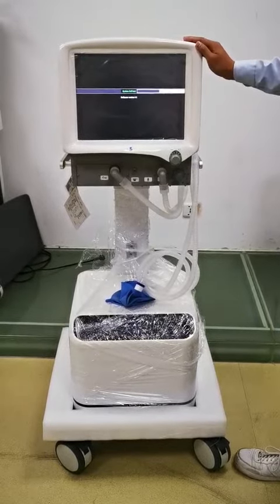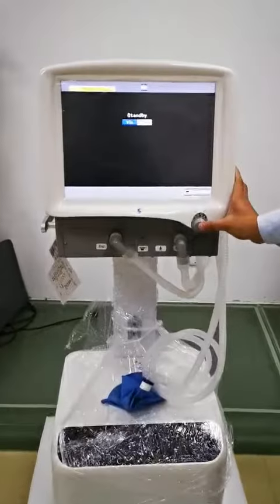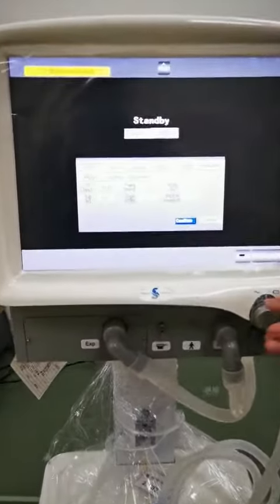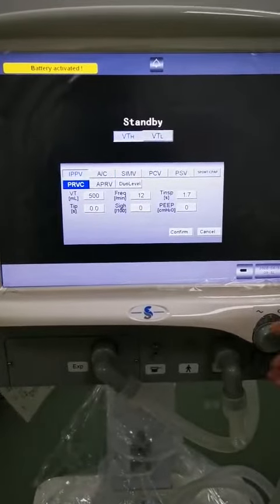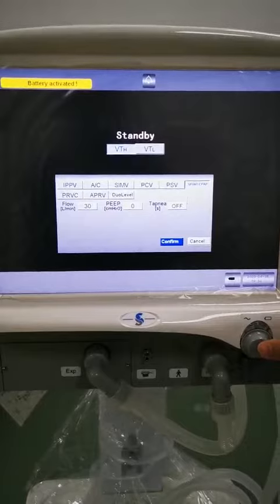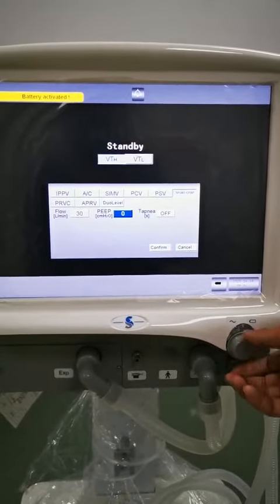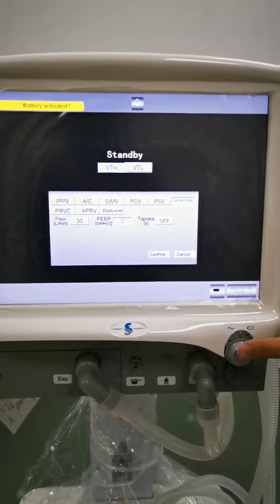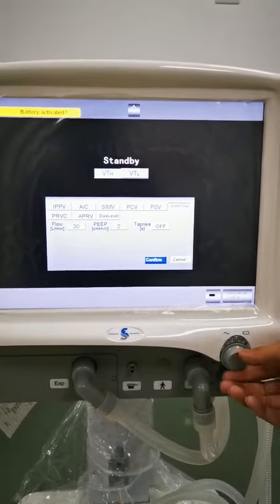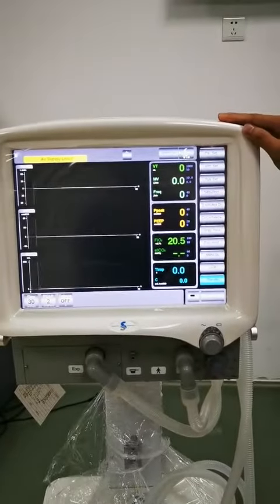The machine will enter into the standby interface. We choose the VTH and the spontaneous PEEP ventilation mode, and we set the PEEP to 2 cmH₂O and confirm. Then the machine will enter into the working interface.